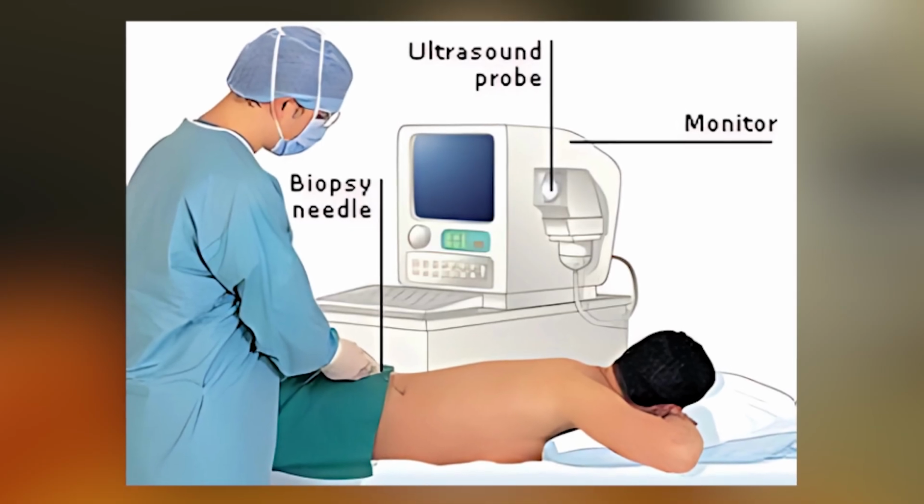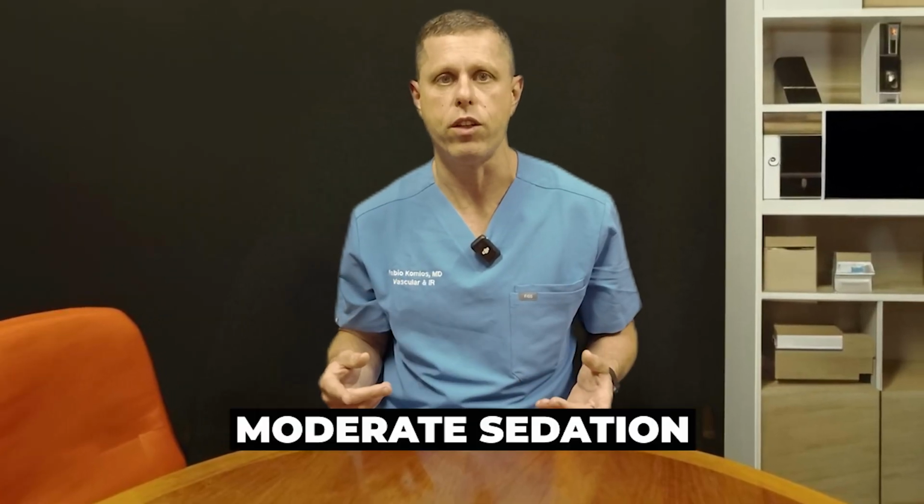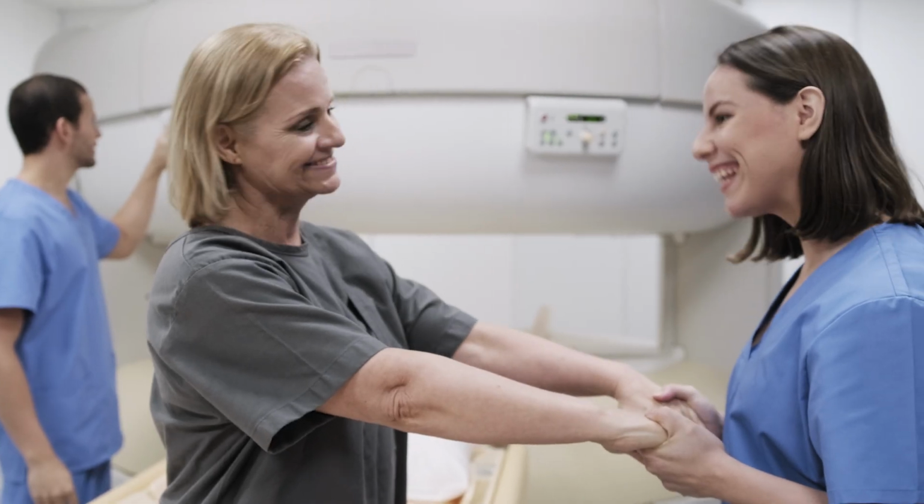When you do the procedure, usually the patient is lying on their belly, and that's because most often we'll access the kidney from your back. We usually give you what's called moderate sedation or twilight sedation. That's when we give you medicine in the IV to make sure you're comfortable. It does not have the same risks as general anesthesia and does not require an endotracheal tube, for example. So the patients are sedated but arousable, and usually they recover pretty quickly. It's similar to what people get when they have, for example, a colonoscopy.